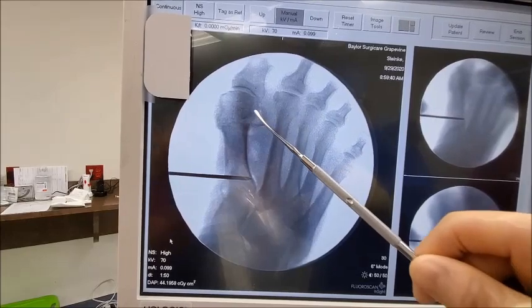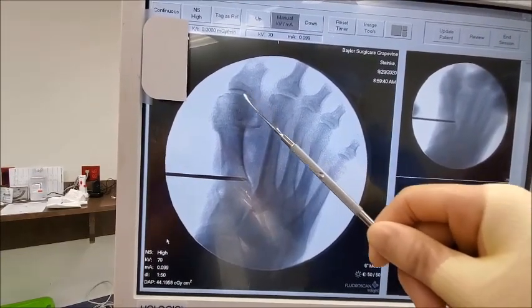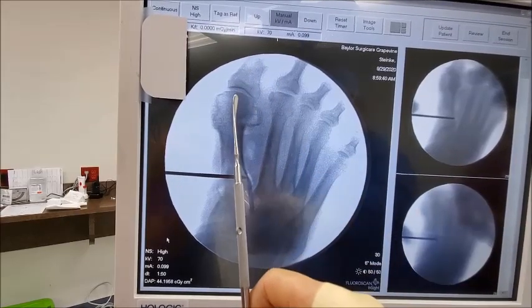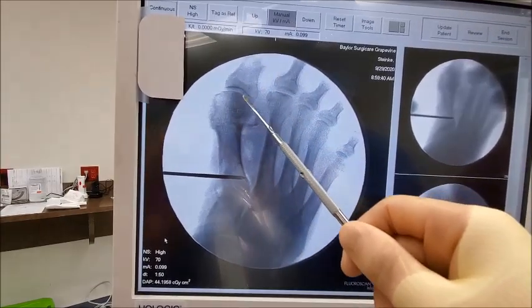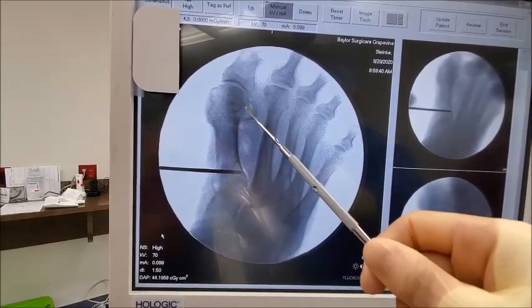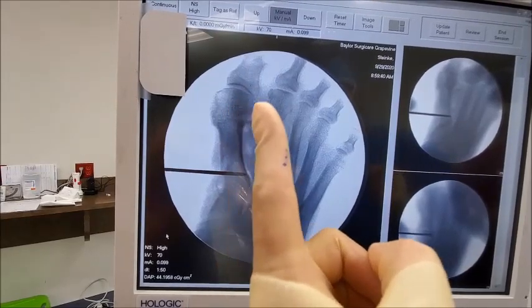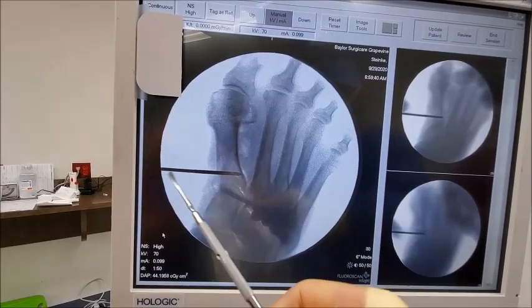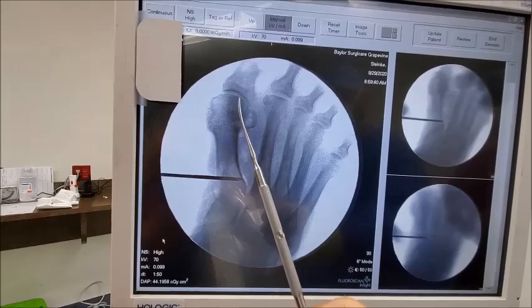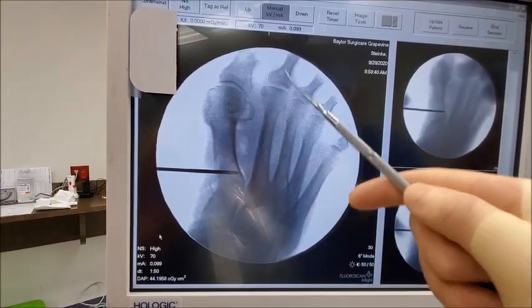We can see here these two round bones — they're very small and difficult to discern. They're called sesamoid bones and they're supposed to sit like little snake eyes underneath the long first metatarsal bone. In this case they've deviated, which is a combination of some arthritis in that joint and also because the bone is rotated to the side. We're using this small guide pin to derotate the first metatarsal to bring it straight and return those sesamoid bones to anatomic alignment.